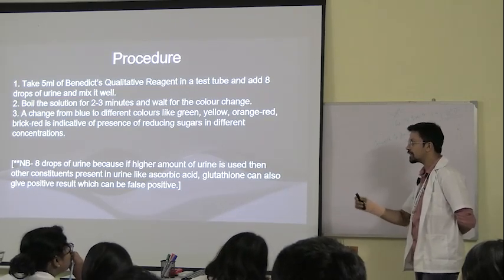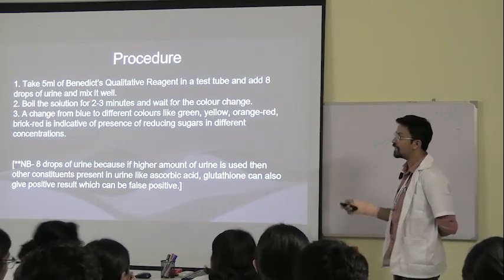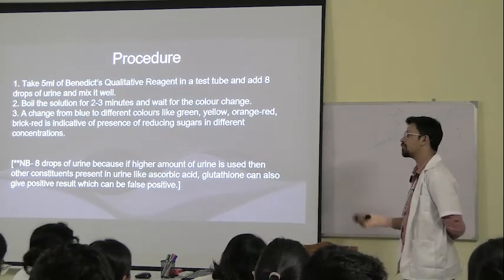Remember, you keep on titrating till the purple color comes. That is titration. So that is how it has already been titrated. It's a fixed amount that has been titrated and tested like that. So we can't change it, like why not 5 ml.